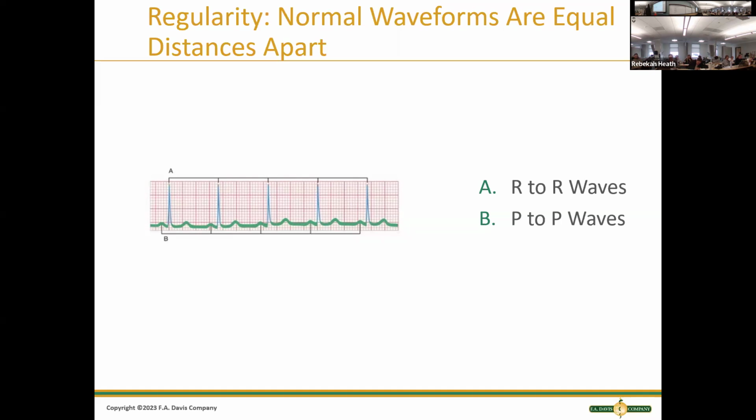Yep. I want you to measure the QRS complex. Extra space. Oh, wait, I think I do. Perfect. Wait, yeah. You should have 2. No. Let's keep that. You want those 2. Okay, okay. Who is missing one?